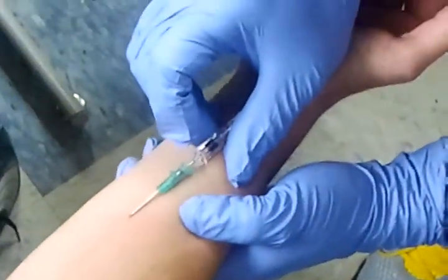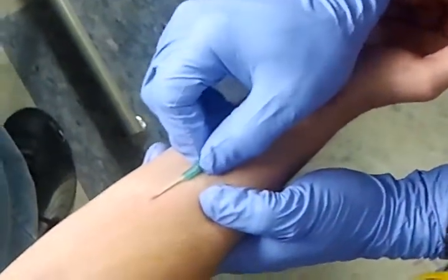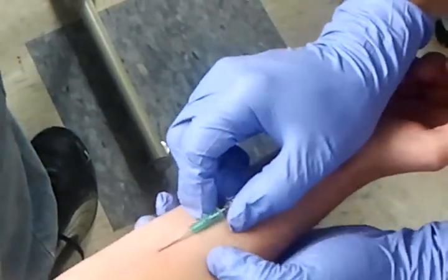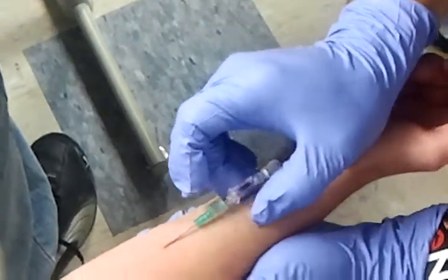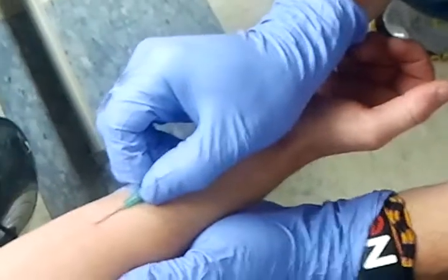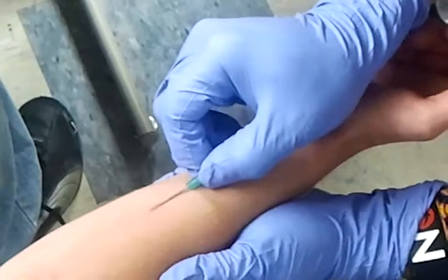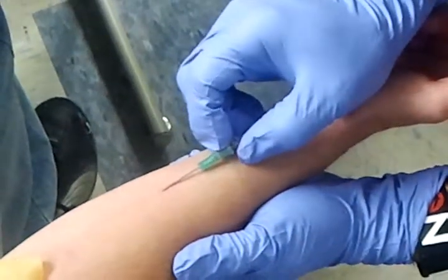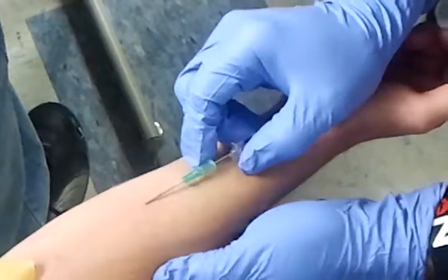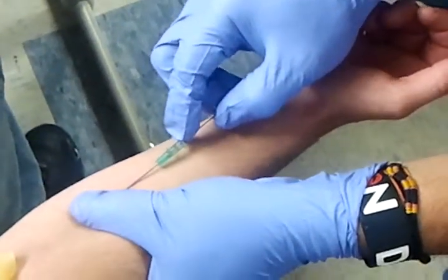I'm getting flash right there — see that? I'm going to try something here, though I don't think it's going to work. I'm getting blood all the way back — see how I'm getting blood? So I want to try something here. Somebody give me the IV tubing.